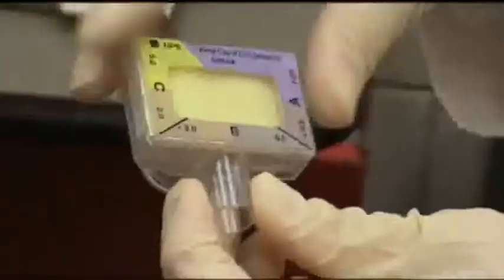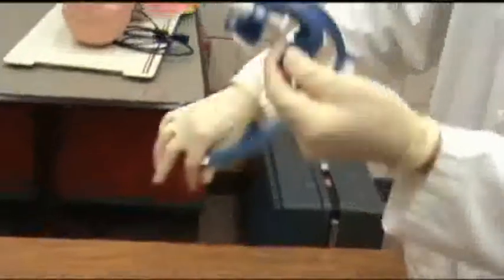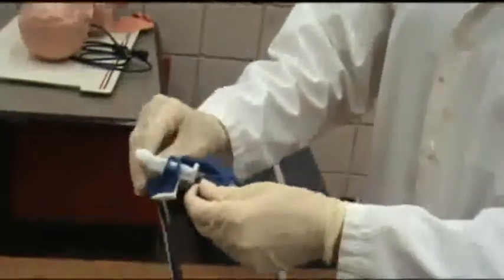This is the end-tidal CO2 detector, also called capnography. When you attach it to the bag valve mask, you can make sure that your patient is breathing correctly and that you have correct tube placement. This device will secure your tube to the patient so that it doesn't move or become dislodged. You can also use tape, and there are other devices available.